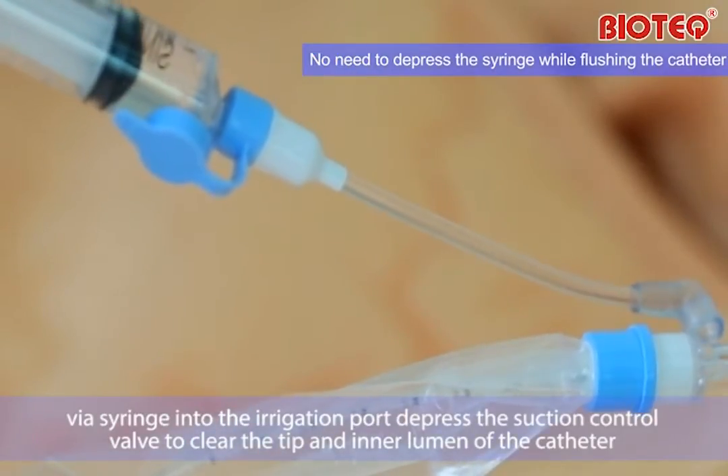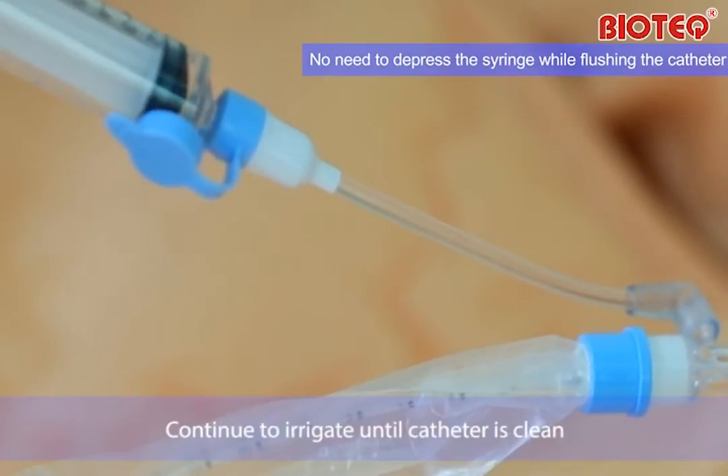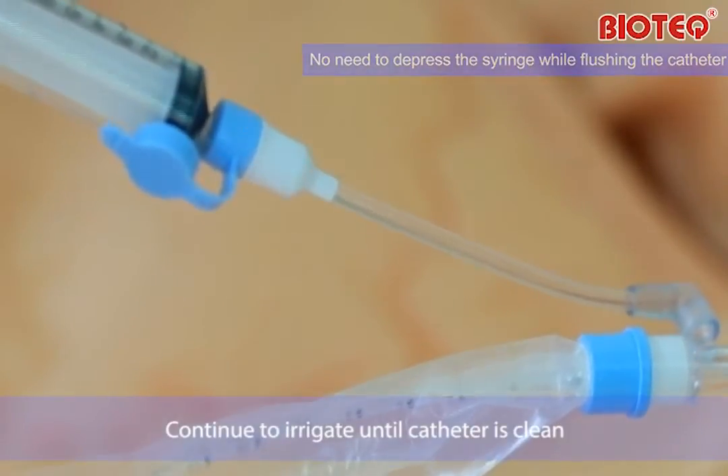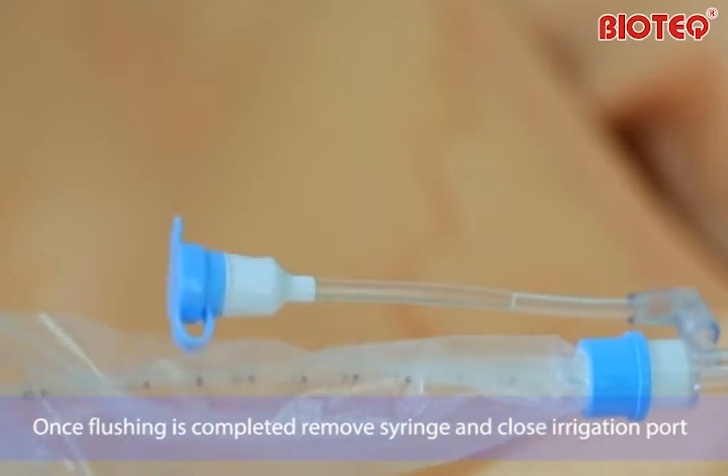Depress the suction control valve to clear the tip and inner lumen of the catheter. Continue to irrigate until the catheter is clean. Once flushing is completed, remove the syringe and close the irrigation port.